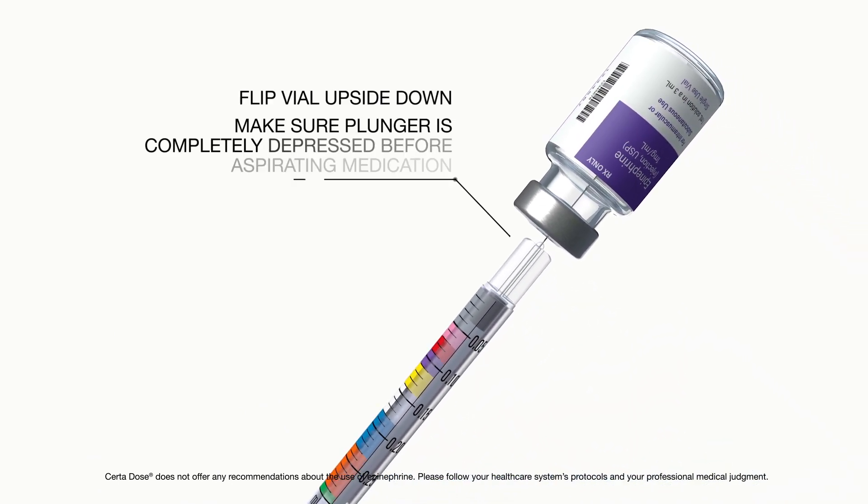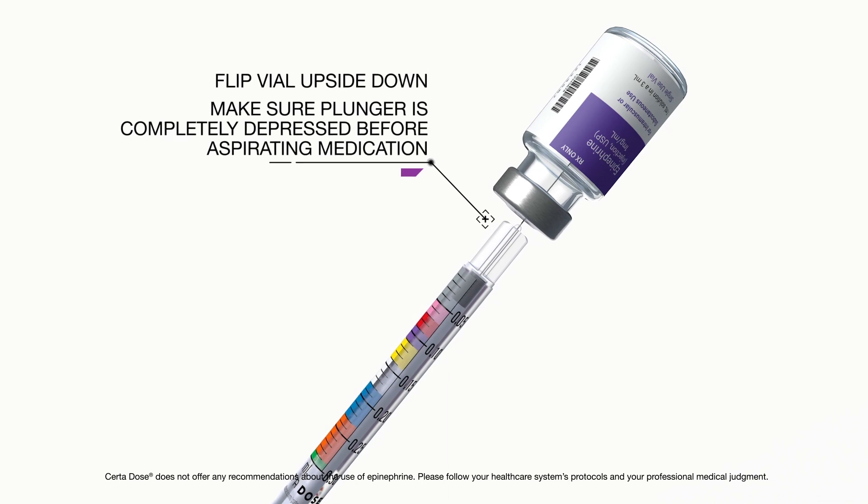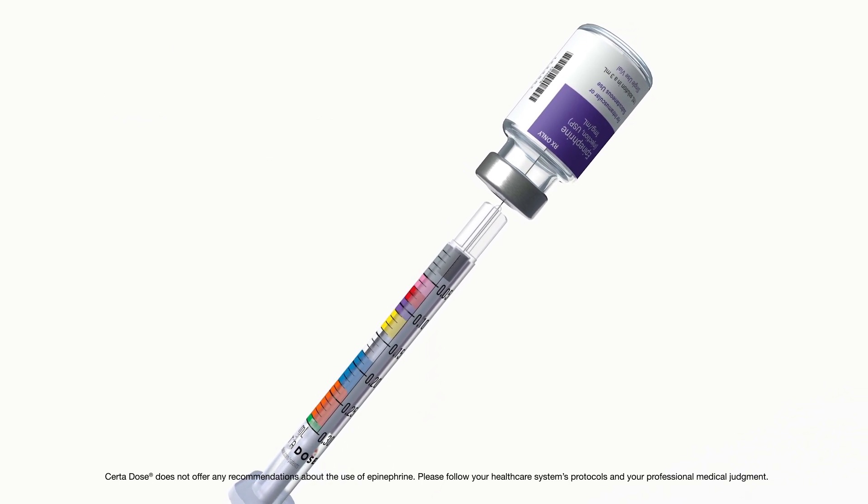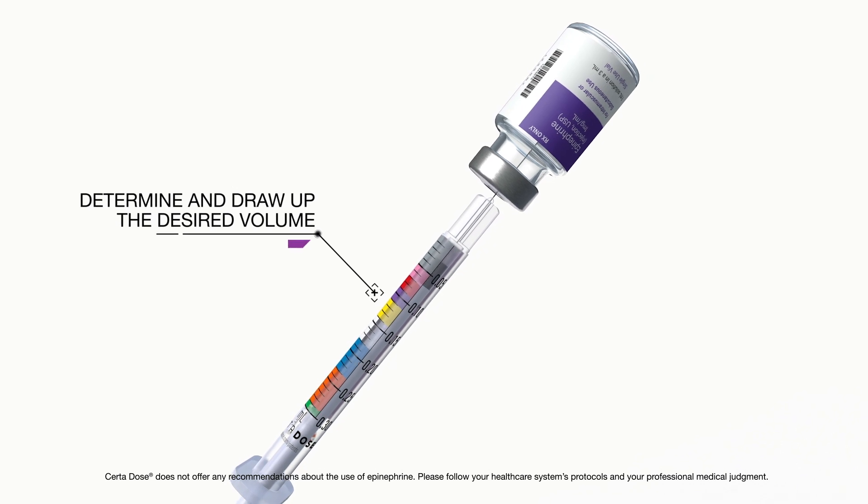Flip the vial upside down. Make sure the plunger is completely depressed before aspirating medication. Determine and draw up the desired volume.